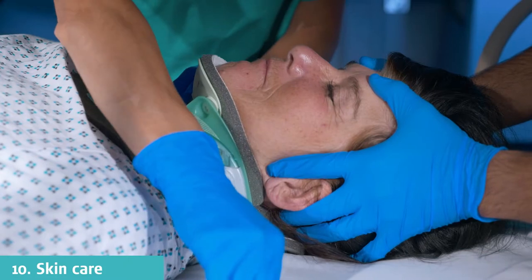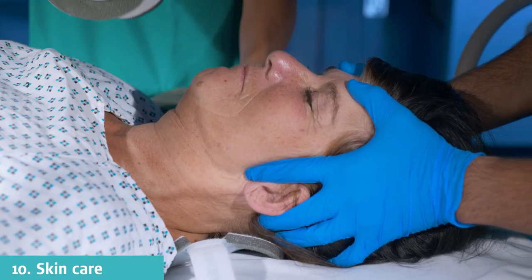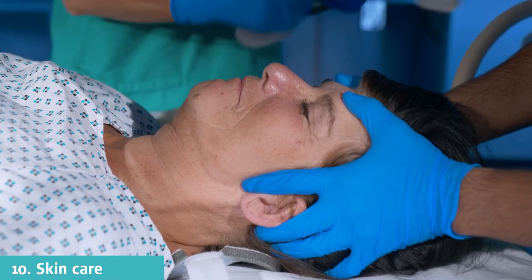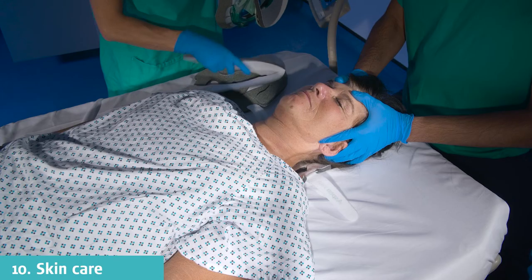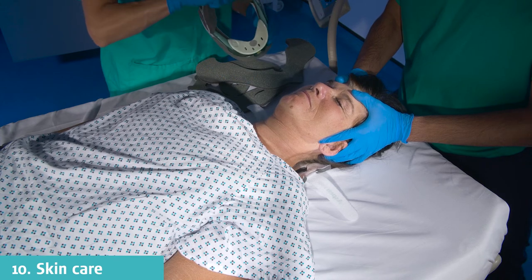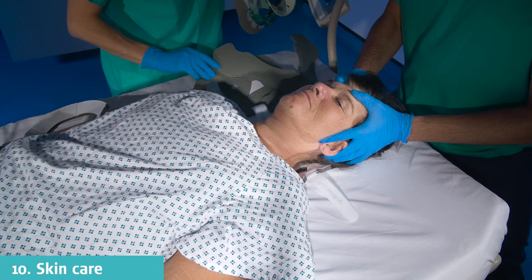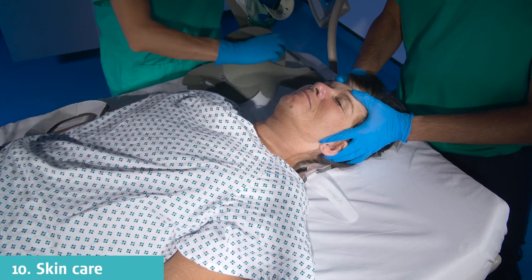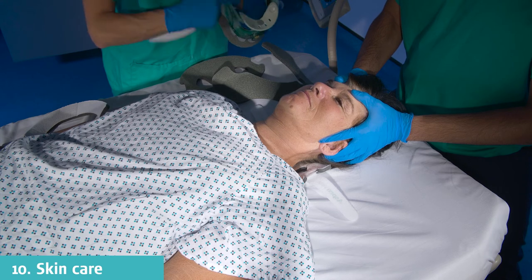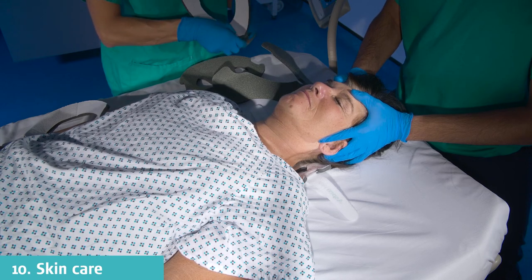Remove the collar at least once per shift. A head hold should be performed on patients that are bed bound with unstable cervical spine injury. Any device in close contact with the patient's skin can increase the risk of pressure damage to the skin. This is caused by an increase in skin temperature and excess skin perspiration. In patients with moist skin, skin breakdown is increased fourfold compared to those with dry skin.